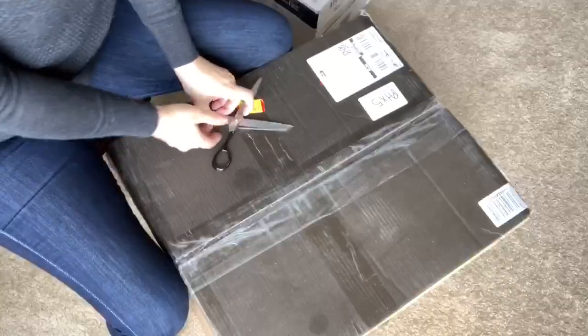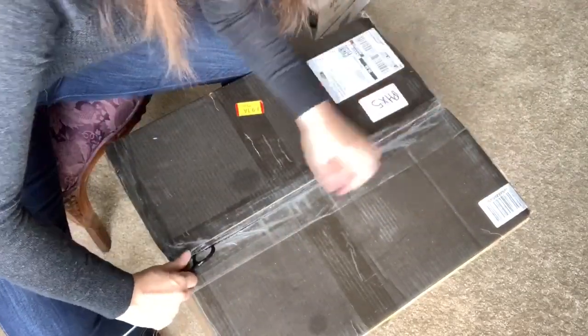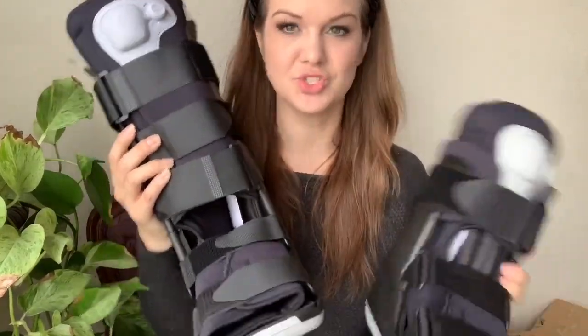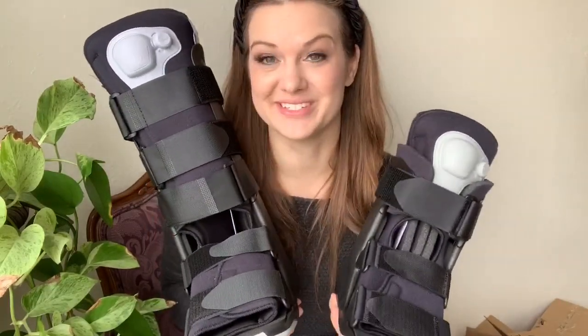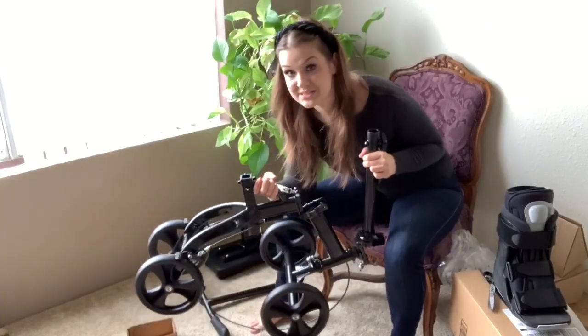On to the knee scooter — I'm imagining some assembly will be required. The first thing in this box is another walking boot. I don't know if that's a mistake or what, but it's also a size small from the same company, with the same air inflation. One's a tall boot and one's a short boot. I don't really know why I have two, but yay — two walking boots!